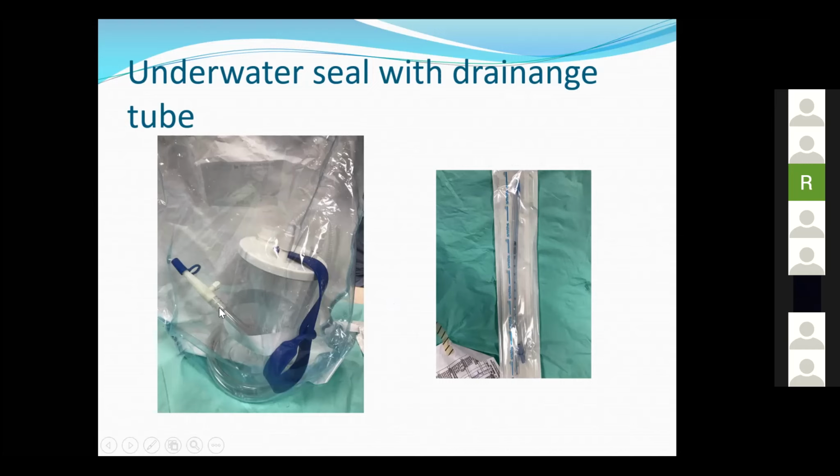And if you see, we connect it to this tubing. It has a tube, and this is connected to a long tube. It goes down to the base of the bottle, and we fill this part of the bottle with water, and it has another tubing here which is just lying up here. This does not sink into the water. This equalizes the pressure with the atmosphere.